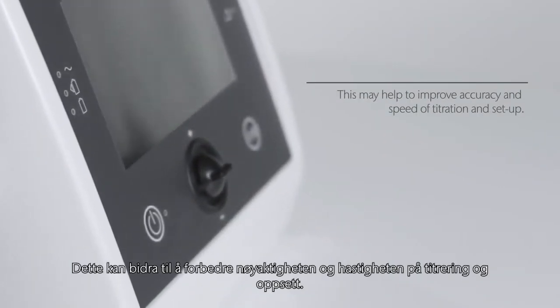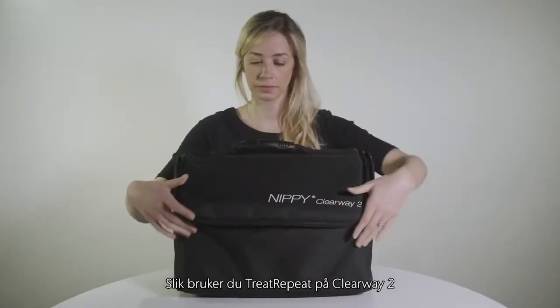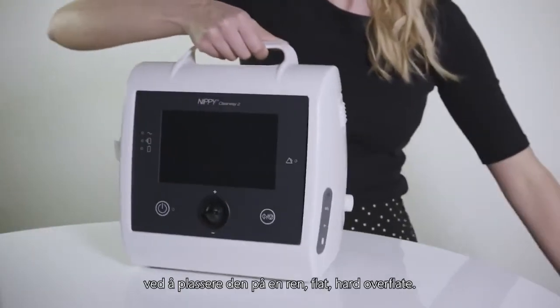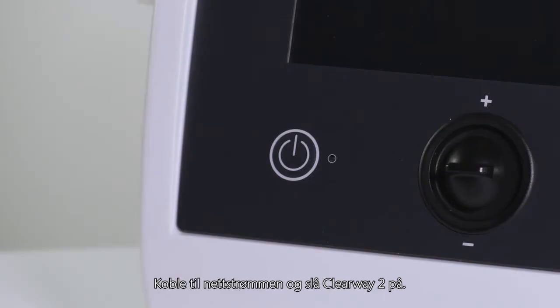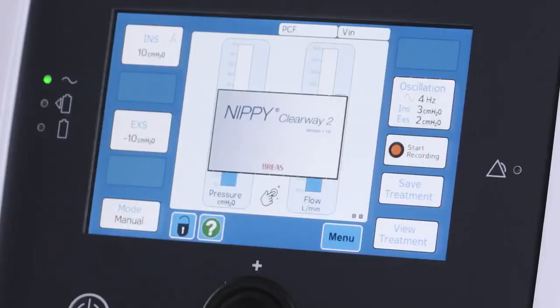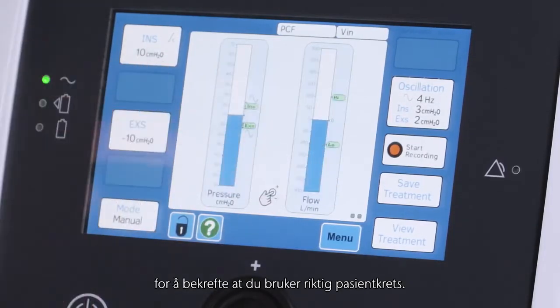This may help to improve accuracy and speed of titration and setup. To use Treat Repeat on the Clearway 2, set up the device as normal by placing it on a clean, flat, hard surface. Connect the mains power and switch the Clearway 2 on. Press the green check button to confirm you are using the correct circuit.